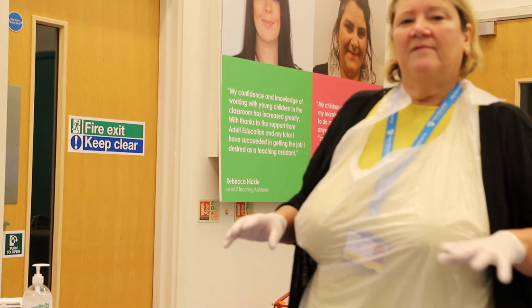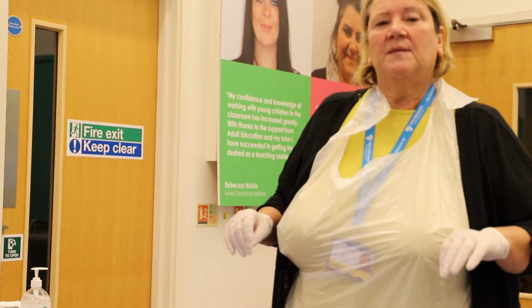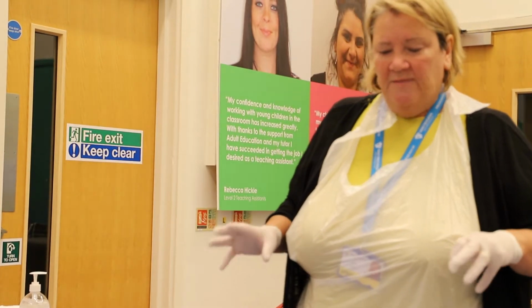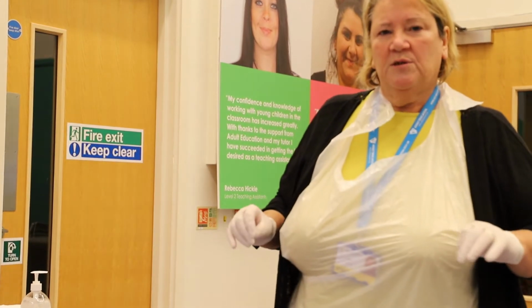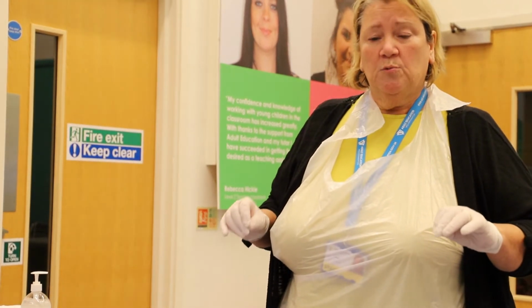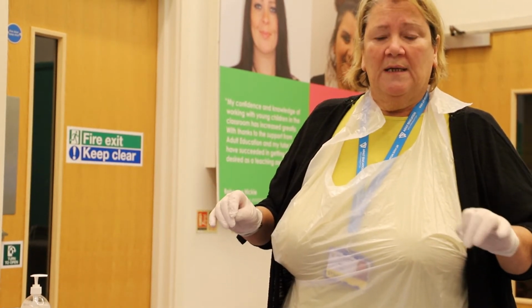We're going to do a first aid session and we're going to look at CPR and the safe use of the defibrillator. So first of all, we need to follow the procedure Dr. ABC. So we need to check for danger, make sure the area is safe for us to approach, make sure there's no hazards. Hazards could be to us, electrical cables, children, family members or members of the public.